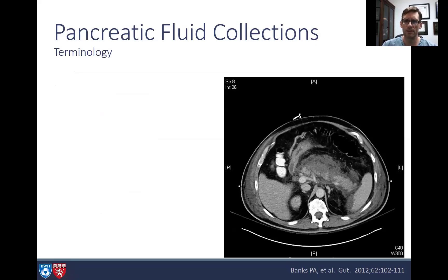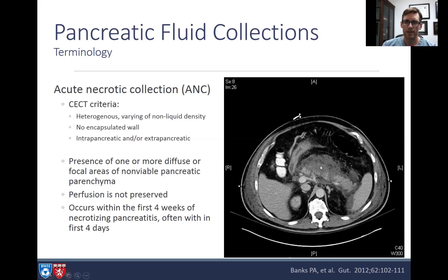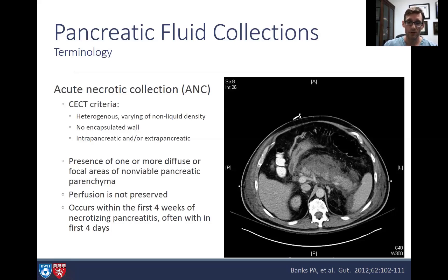You can also treat pseudocysts with pigtail stents. Now here we have something more heterogeneous — an acute necrotic collection. The CECT criteria include heterogeneous varying non-liquid density components, no encapsulated wall, and it can be intrapancreatic and extrapancreatic. These darker areas represent non-viable necrotic pancreas, typically occurring within the first four weeks. You would not be placing a lumen opposing metal stent into this.